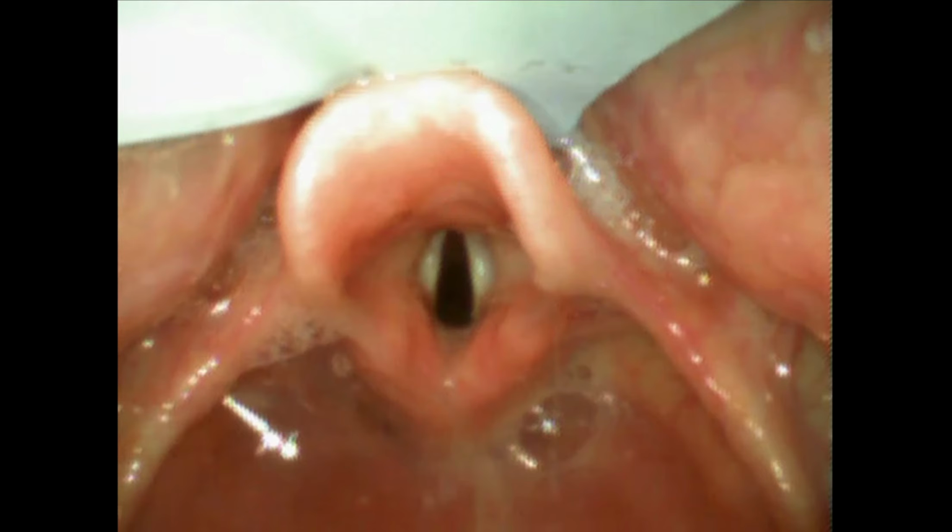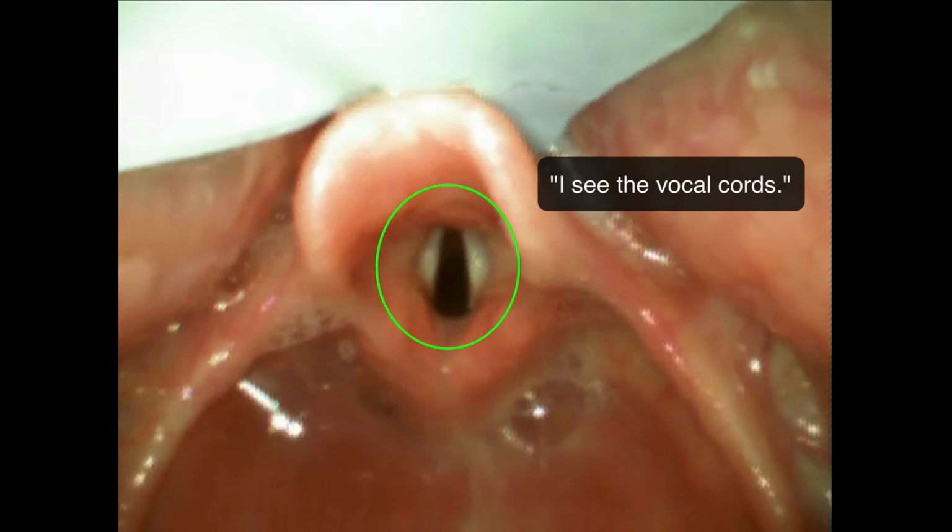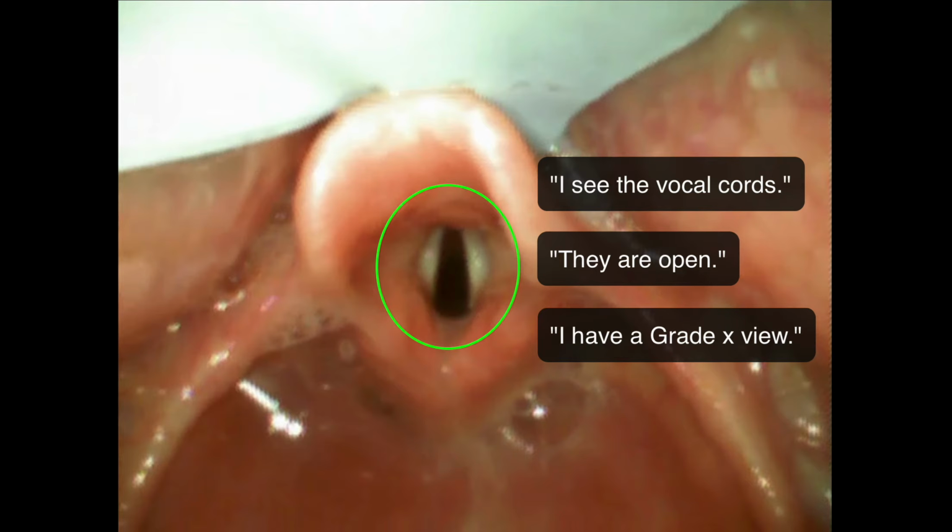One of the keys in any intubation is communicating with the other people around you. So what typically happens is folks that are learning to do intubations tend to be very focused on what they're doing, and they forget that there's a team around them that are there to help, and they do it in silence. And so I think some reassuring words to always hear from whomever is doing the laryngoscopy is to say things, for example, I see the vocal cords. You'd be surprised. Lots of folks will just do silent intubations, and everyone else is left to wonder, what did they see? How did it go?